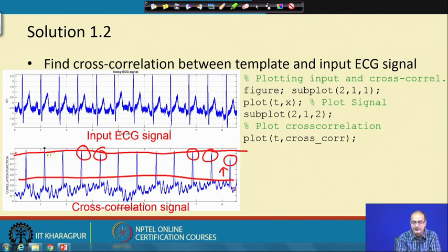So, there is a contradiction. If we take the threshold very high, we have insufficient averaging because the number of beats we could catch is less, and the noise suppression would not be complete. When we push it very low, the spurious peaks come and disturb the signal morphology, changing it.